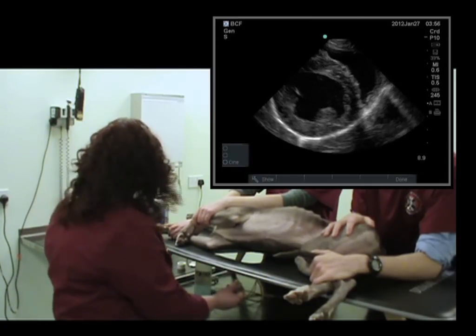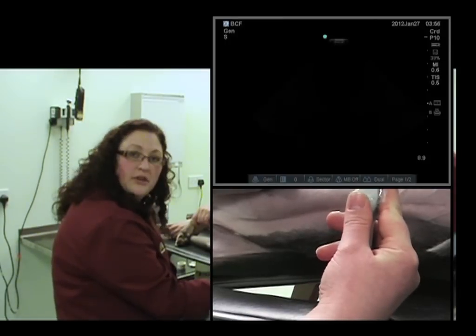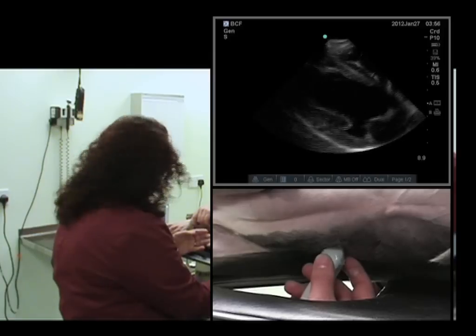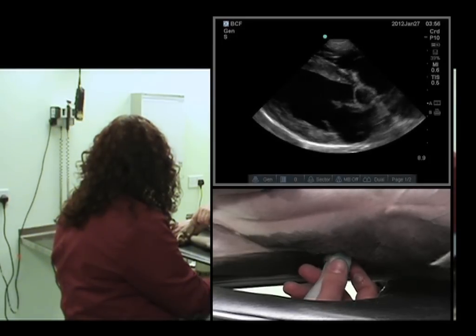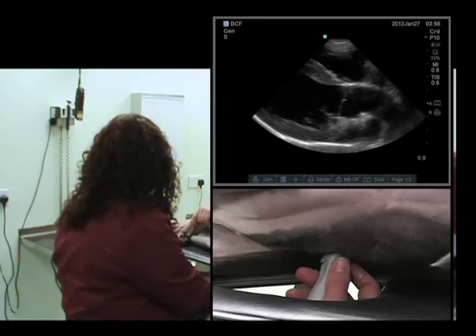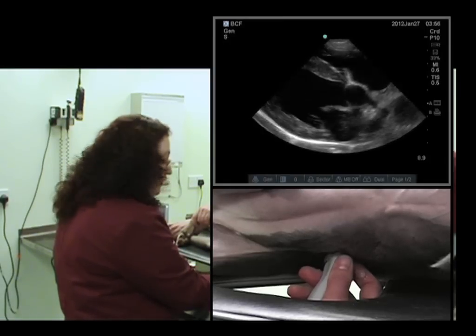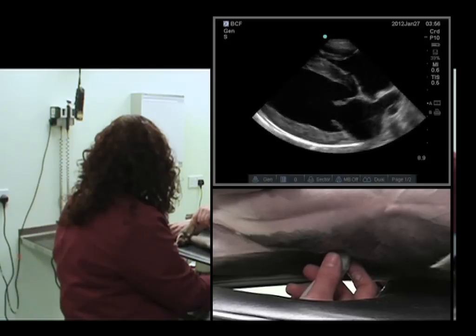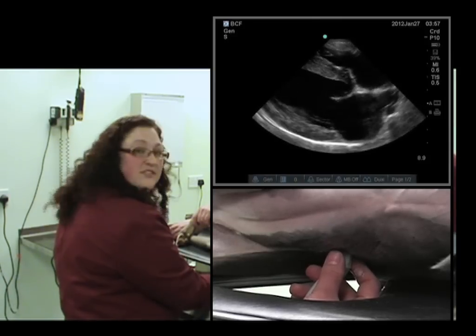We'll just look at how to obtain that one more time. I have my thumb on the marker — the thumb will be pointing towards the sternum — and we'll obtain the long axis 4-chamber view. I'll feel for the apex beat, go in the intercostal space, and we actually have the 5-chamber view. If we were in the 5-chamber view and wanted to get back to the 4-chamber view, we just do the opposite and rotate the probe clockwise ever so slightly, about 10 to 15 degrees, and we obtain our right parasternal long axis 4-chamber view. It just takes practice to get these optimized.